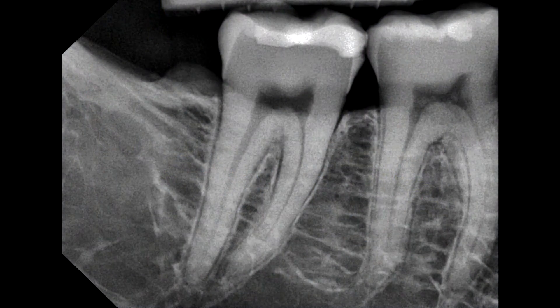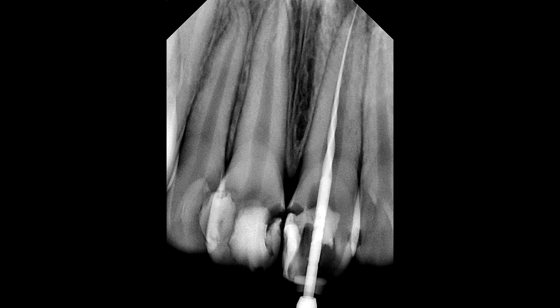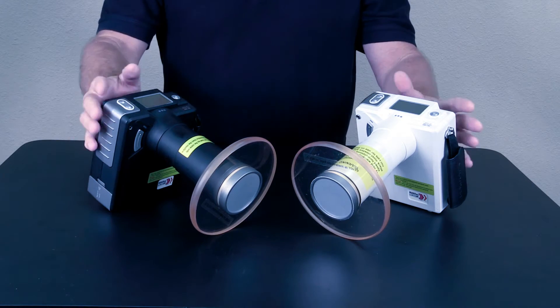Here are some images taken with the MaxRay. Low dose to the patient, basically no dose to the user. The absolute best handheld on the market, hands down.